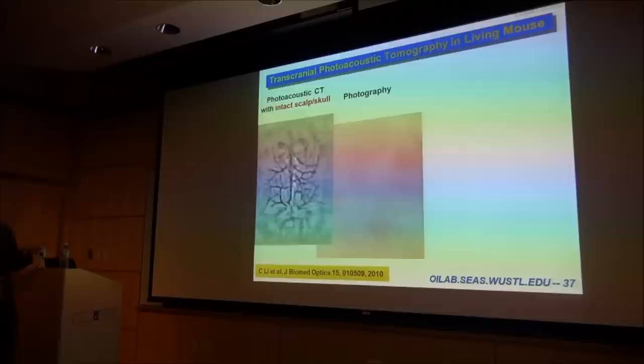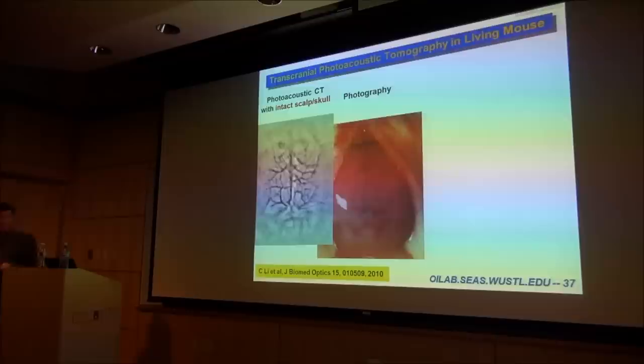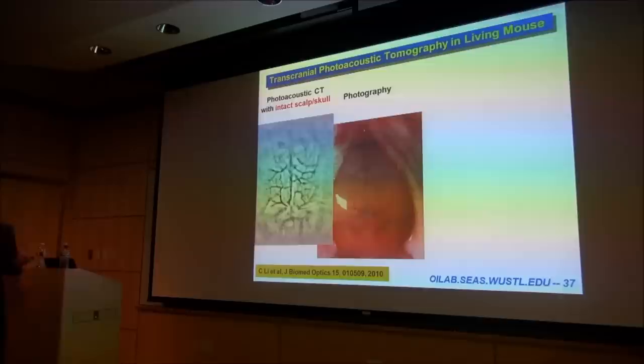Now, if you remove the skin, this is what you see with the naked eye. Right? The skull is intact, but the skull is translucent enough for us to see all the detailed structures. You compare this non-invasive photoacoustic image with this invasive photograph. You see how well they match all the bifurcation points.